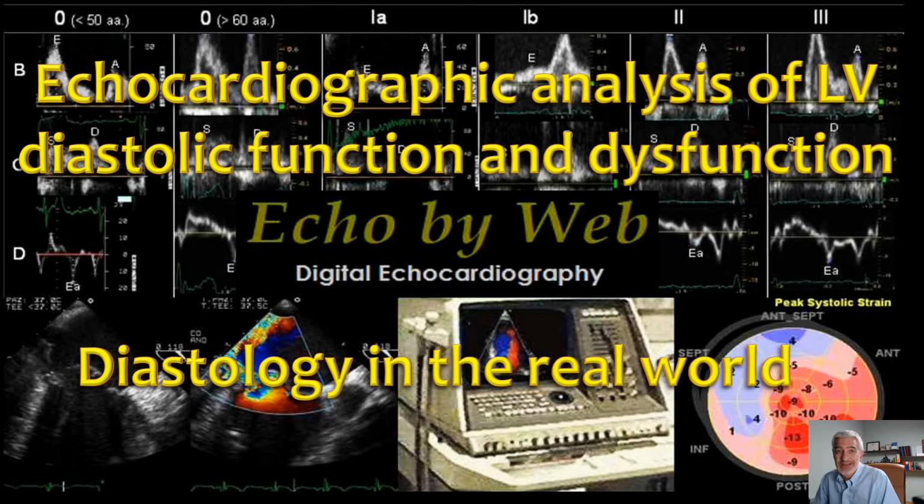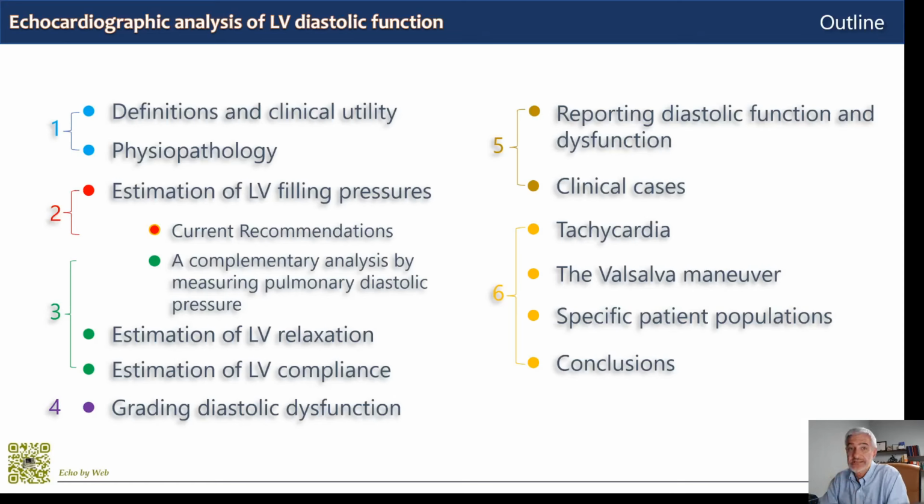However, you will find on the website echobyweb.com a large quantity of educational materials to address these topics. This is an outline of the 6 talks on the echocardiographic analysis of left ventricular diastolic function and dysfunction.